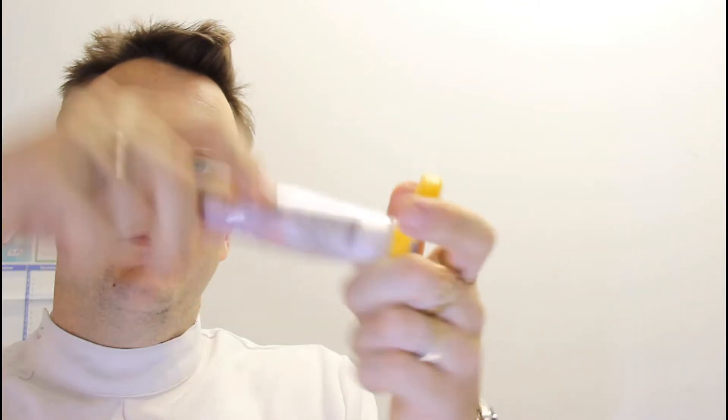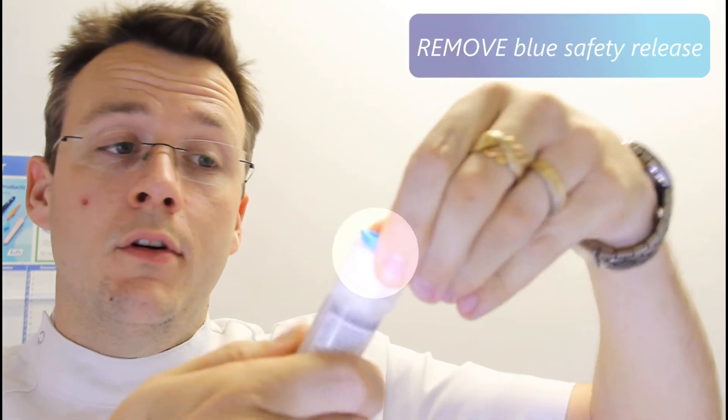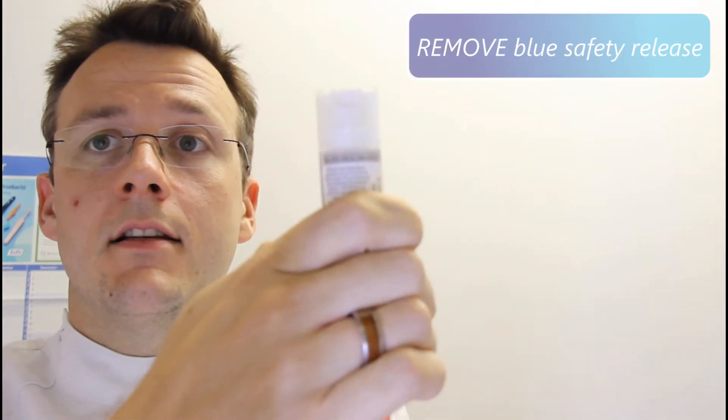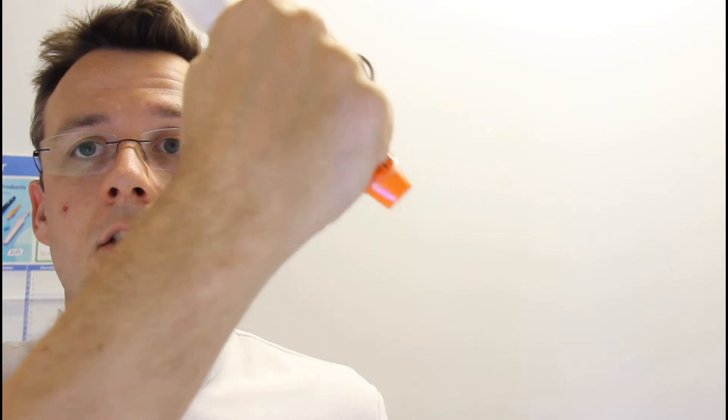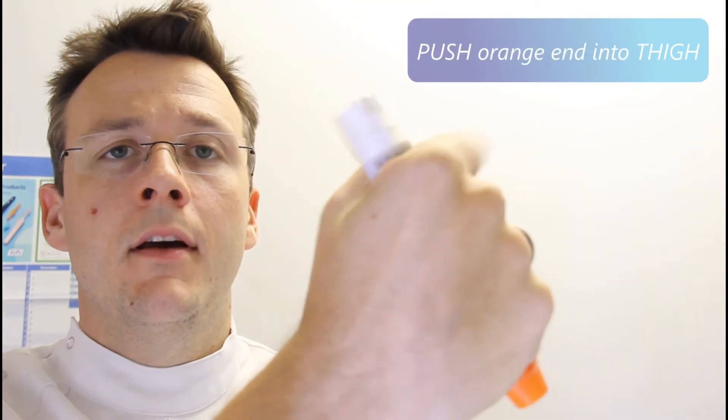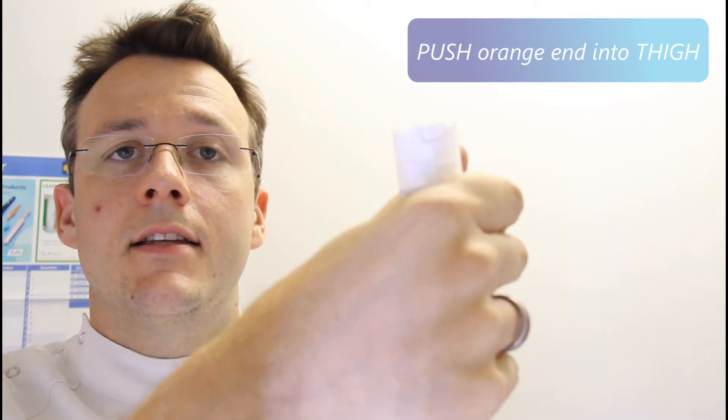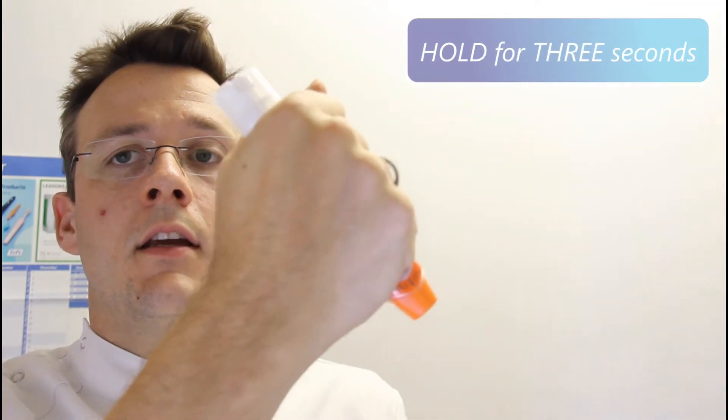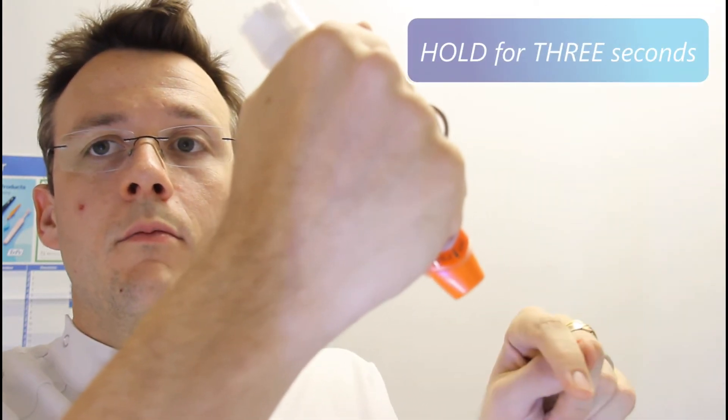So we all know to activate the EpiPen, you have to remove it from its protective case, take off the blue safety release, and now this is a live EpiPen. So to activate it, you push the orange end into the limb, preferably the thigh they say, and hold it for three seconds for the adrenaline to move into the body.